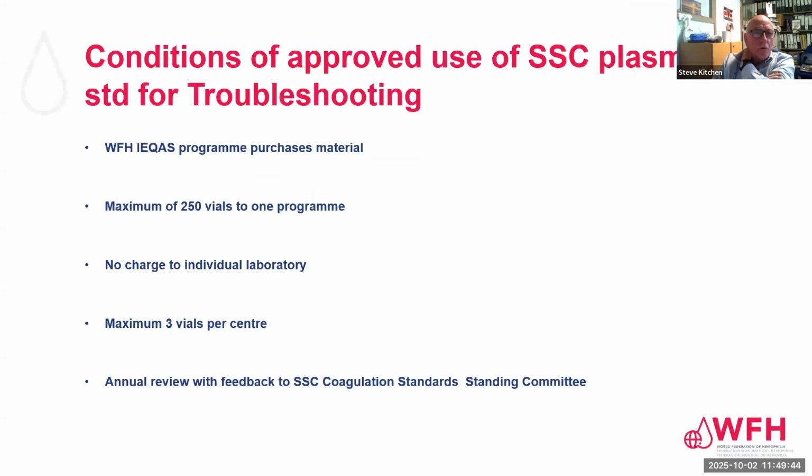And so to help troubleshoot and investigate this, for a lab that is using reagents that have been shown to give good results in many other centers, and that's often the case, we are able to provide some material as a tool to investigate possible calibration issues. We purchase SSC plasma from ISTH SSC. We hold a stock. We don't make a charge for this, but we are permitted to provide up to 3 vials to an individual center. We have to feed back to the standing committee on our use of this. Next slide, please.